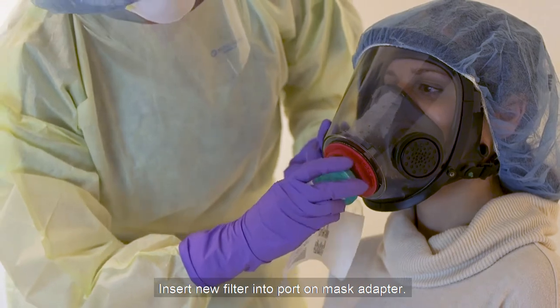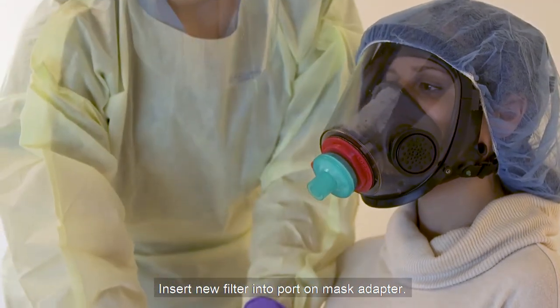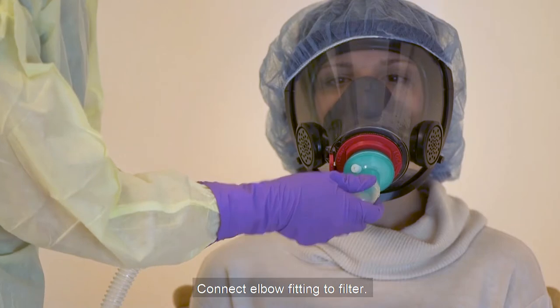Insert a new filter into the port on the mask adapter. Connect the elbow fitting to the filter.